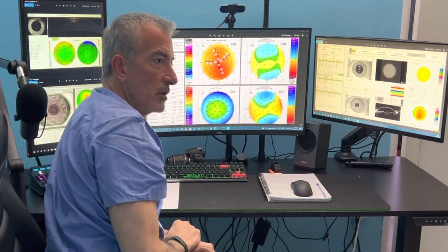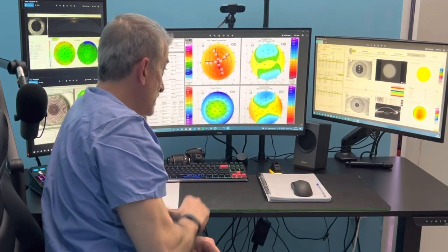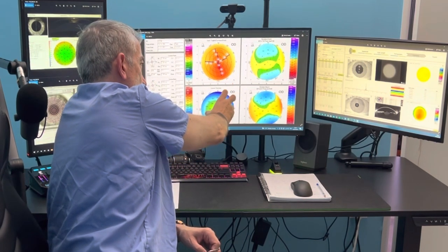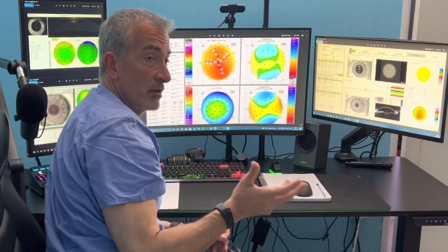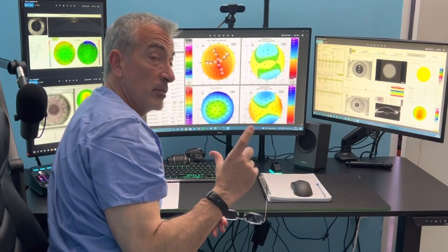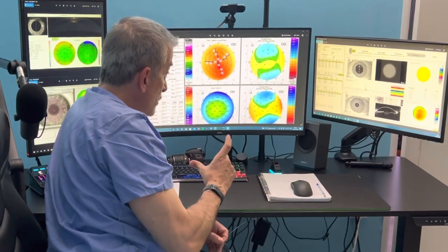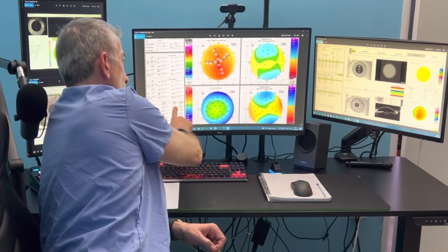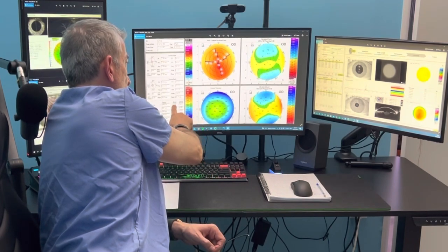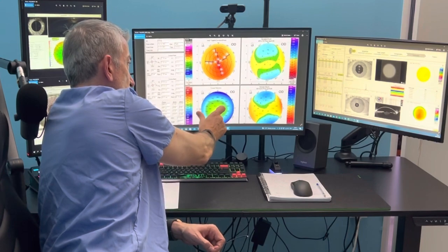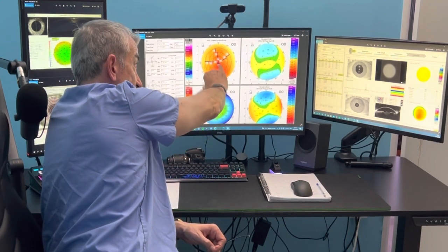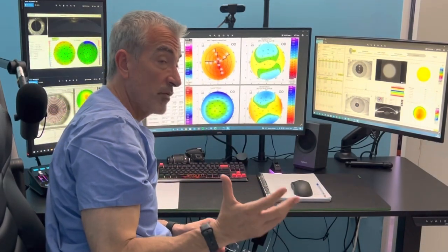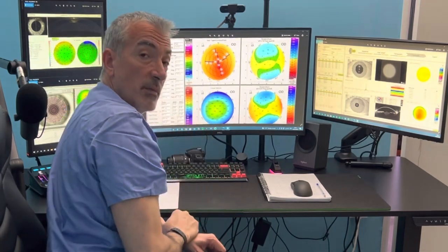We've talked about this also at the recent ASCRS meeting in Washington, DC. This is my go-to map. These escalations from thicker to thinner in any cornea — even corneas that have five diopters of astigmatism — have to be round and have to be centered to the pupillary center, unless there's significant angle kappa documented by the X-Y axis deviation of the pupillary center to the center of the cornea. This is the experience of 30 years of refractive surgery within one set of maps.